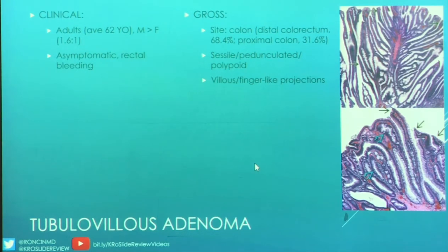Well, from my experience, I've usually seen either they're definitely sessile and polypoid. Sessile and polypoid always seem to go together, I think, or they're pedunculated and either polypoid or villous. And again, villous, or finger-like projections, or what's another term? Filiform. All those things mean almost like ferns, very long and wavy.